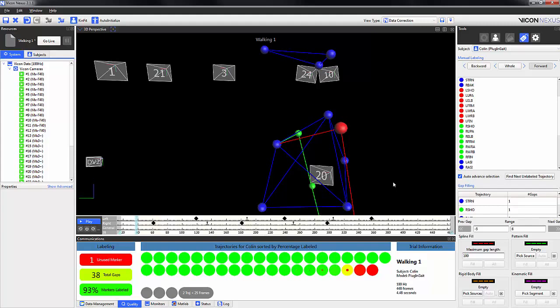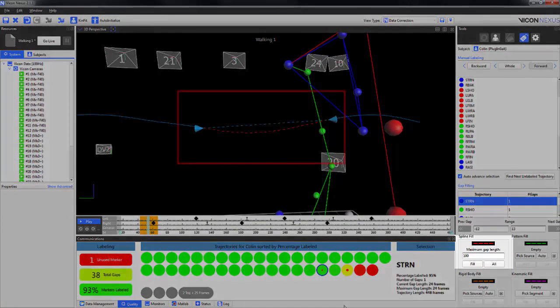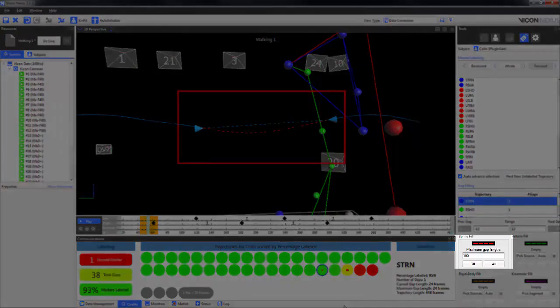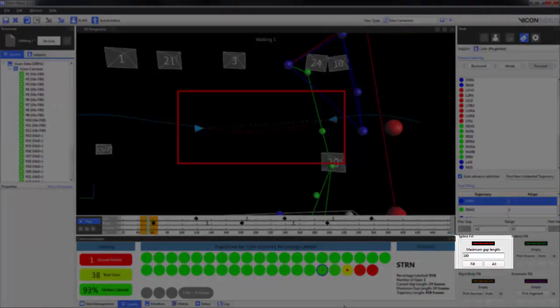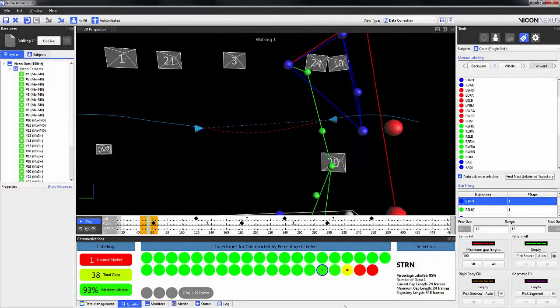By selecting a marker with a gap, you can see here that like in Nexus 1, the red dotted line represents the trajectory of the spline fill. A feature new to Nexus 2 is the ability to graphically assess which filling option is the best.